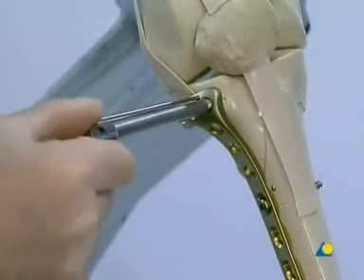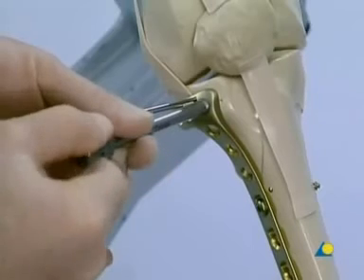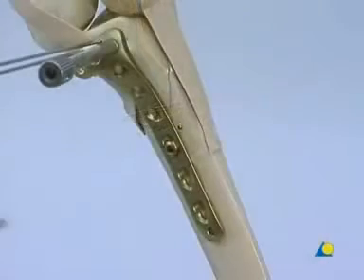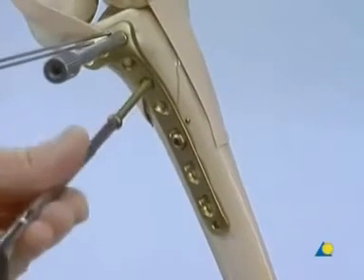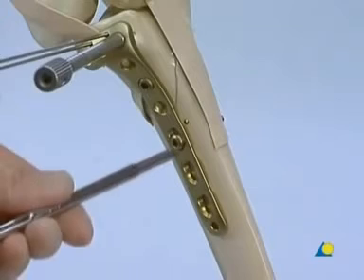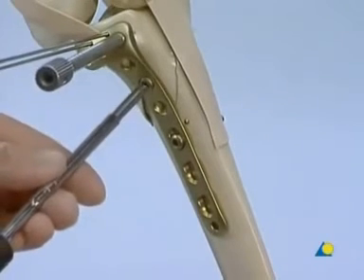The 5.0 threaded LCP drill sleeve is screwed into the most anterior of the proximal plate holes. This drill sleeve will show the direction of the most proximal locking head screw. The plate is secured to the bone proximally by using a 4.5 millimeter cortex screw. The 2 cortex screws are tightened sequentially to maximize the buttress effect.